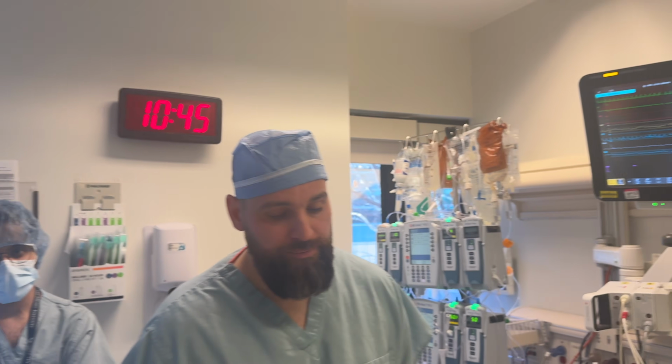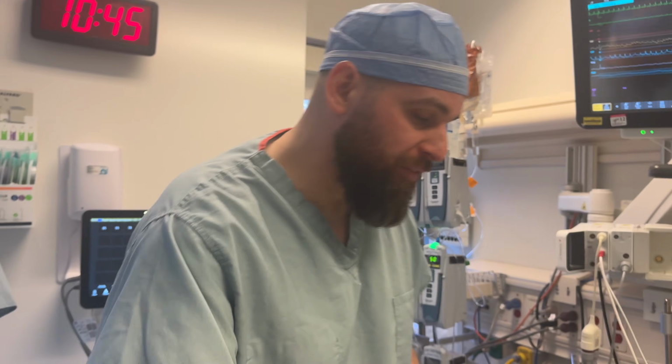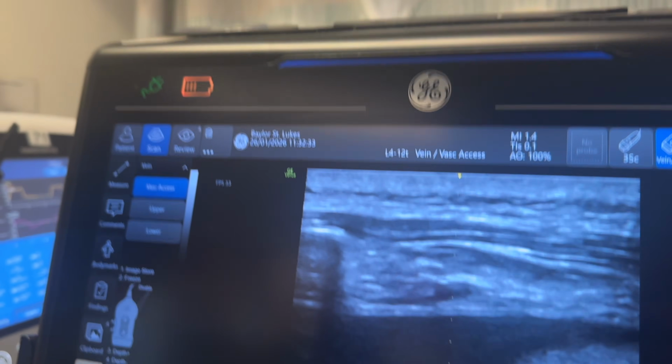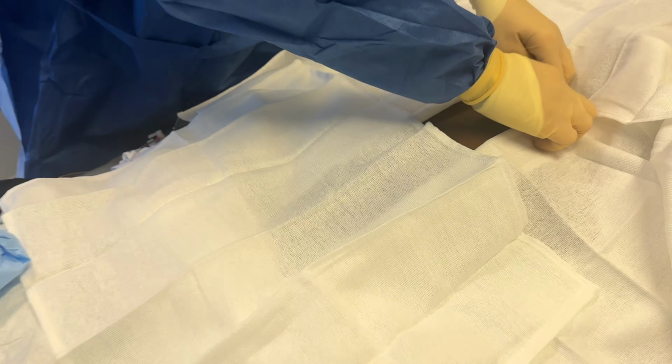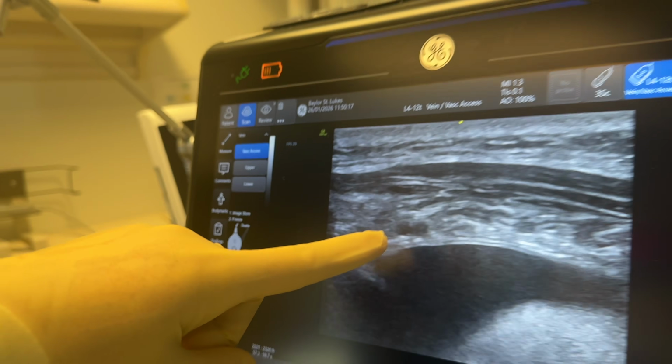A quick question though, are you concerned at all about vessels? You are, yes, and that's why you always have to pre-screen. Right there, okay, and that's your LIMA. So you want to put it in the long axis. You will use your linear transducer probe not only to find where the pericardial fluid is, but where that vascular structure is with color Doppler. You're going to mark it, and you're going to avoid it, and you're going to make sure you never go near that with your needle. So always be careful of the LIMA. It's right here.